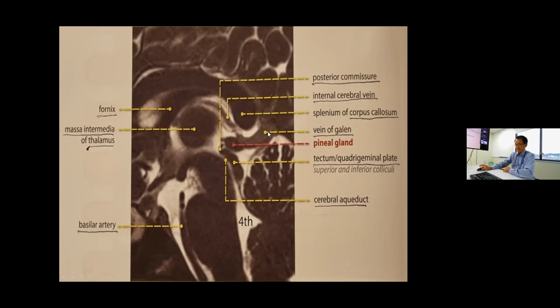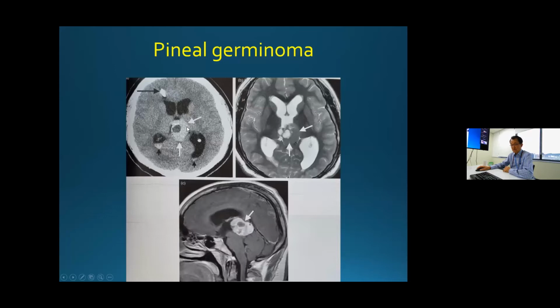So a pineal tumor is a midline tumor, particularly in young people. Of the midline tumors, pineal germinoma is the most common. It enhances, a little heterogeneous. That's the location here.